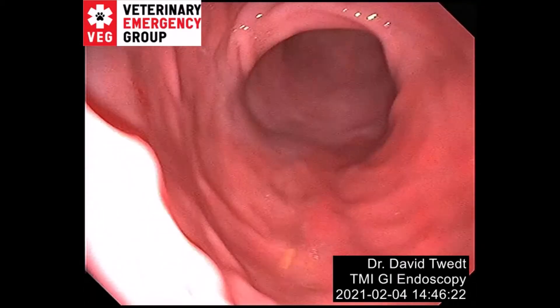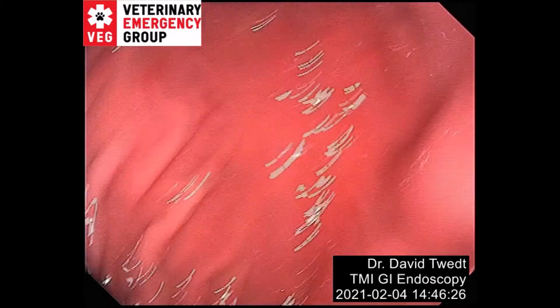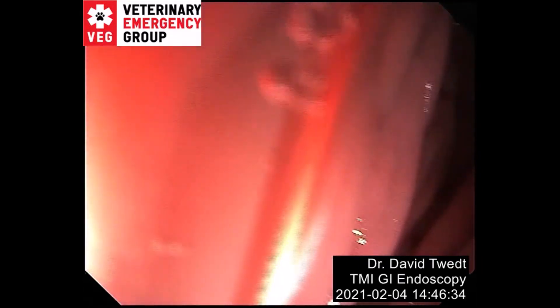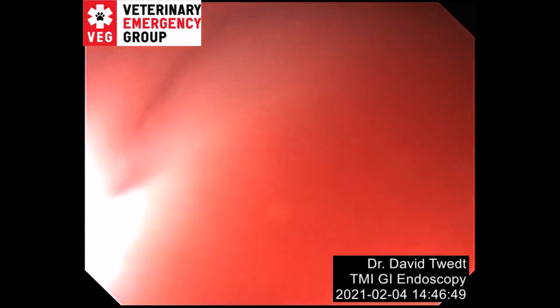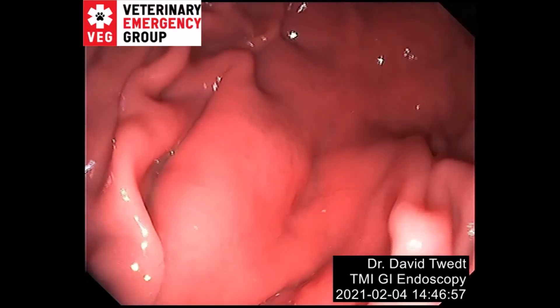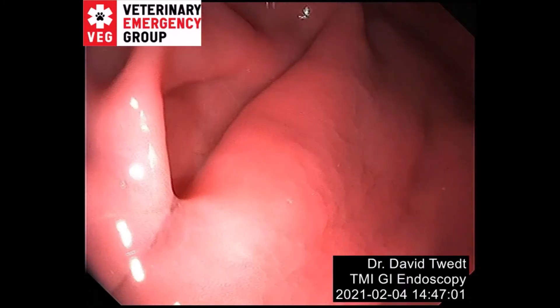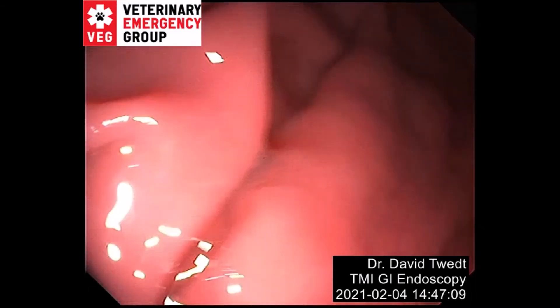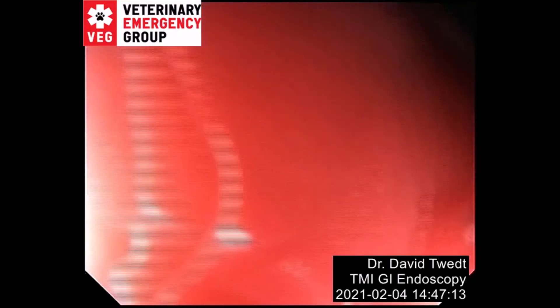And it's just like you did yesterday — you find a foreign body, you see a foreign body, you've got a plan. One important part of the process is how much of your grasper or instrument is extruded out of your scope. The further it goes, the less control you have of it because it's kind of wagging out there. Your plan should be a little bit out, and then I as the endoscopist am the one controlling where it goes. As I get close to my target — that ridge right there — I can tell my tech to advance the instrument a little more, but most of the control and movement of the grasper should be because you're moving it, not your tech.